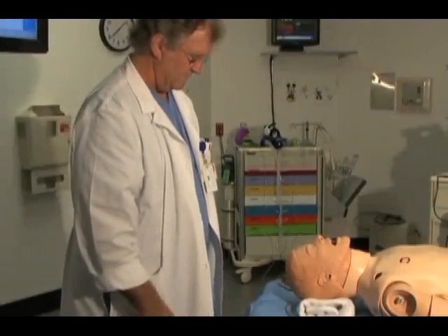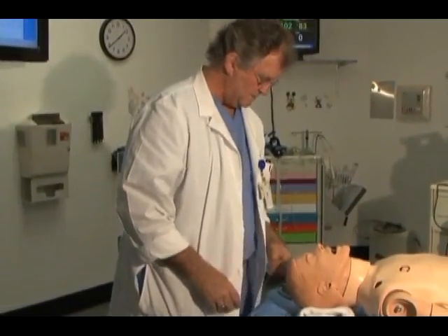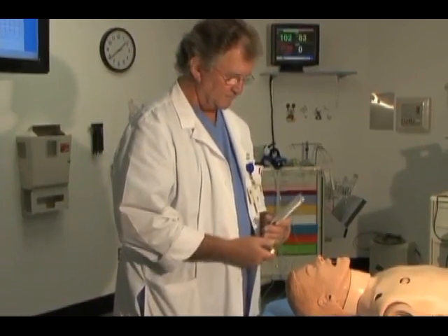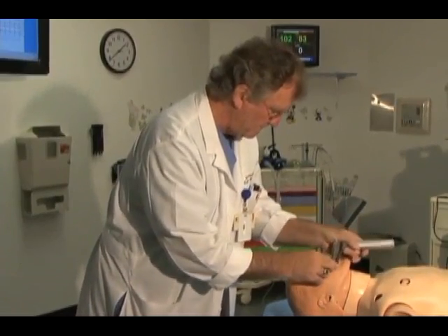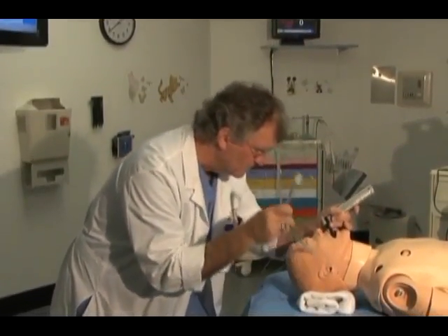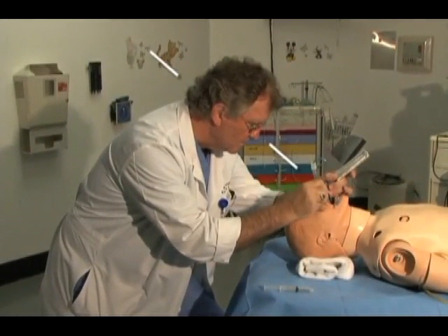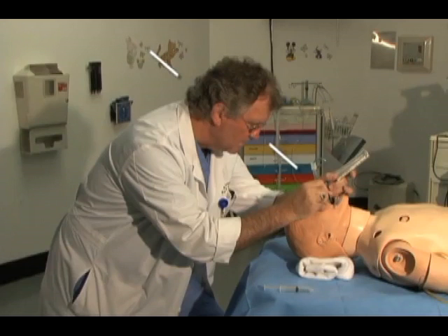This represents a typical adult intubation. The technique, although not optimal, represents an example of what I have observed in several thousand intubations done by emergency physicians taking the airway course. It works for adults, but as we will demonstrate, must be modified slightly for kids. Note the position of the intubator and the visual line of sight used in order to see the glottic opening.